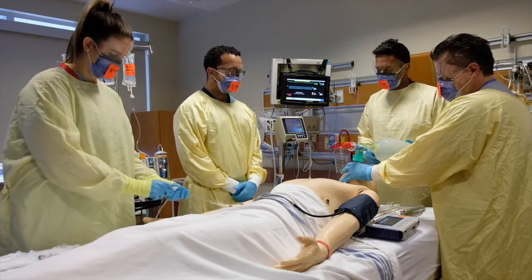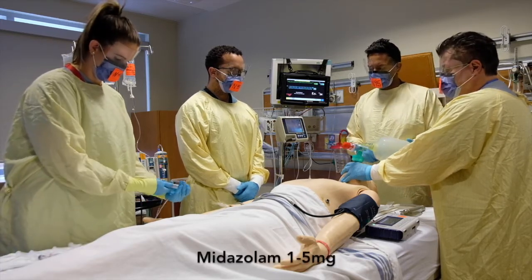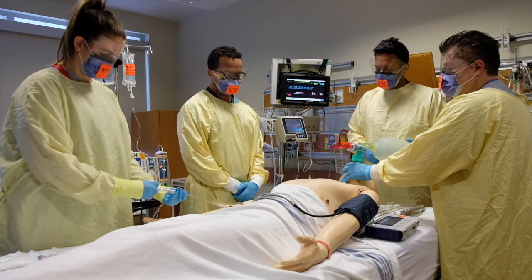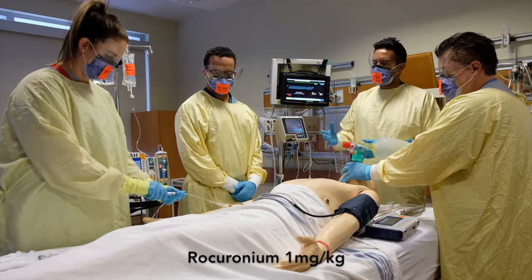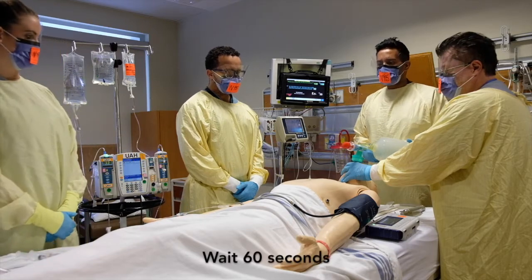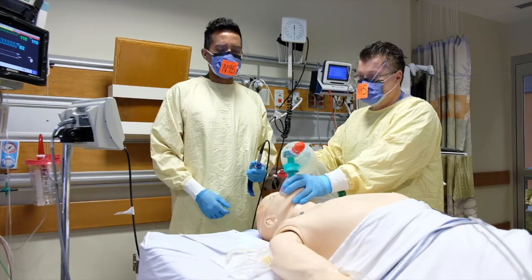Typical doses that you may use will be starting off with between 25 and 100 micrograms of fentanyl, between 1 and 5 milligrams of midazolam, approximately 1 milligram per kilogram of propofol, so in this case we'll use 100 milligrams of propofol, followed by 1 milligram per kilogram of rocuronium. In this case we'll use 100 milligrams of rocuronium for paralysis, and we will wait 60 seconds for optimal intubating conditions. So after 60 seconds have elapsed, we will proceed with intubating the patient.